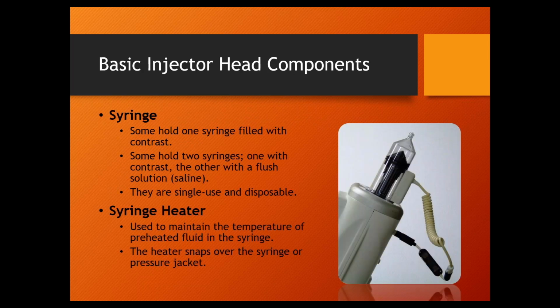Now the syringes, yep, I'm gonna take this off. The syringes are model specific. Every contrast injector, with a couple exceptions, there's 2 exceptions, but for the most part, every contrast injector, the syringes are model specific. For instance, this is a Stellant, obviously. These syringes are Stellant syringes. These syringes don't fit on any other contrast injector model in the world, right? And every other contrast injector model is like that.